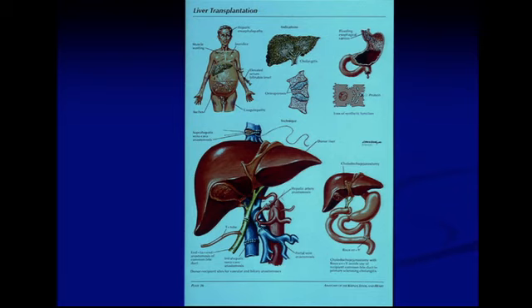In terms of the implantation of a donor liver into a recipient, following hepatectomy, we have to do biliary, arterial, and venous anastomoses. So this is showing you a choledochocholedochostomy anastomosis on the image on the left. It's showing you a direct recipient hepatic artery to donor hepatic artery anastomosis, and it's showing you a portal venous anastomosis.